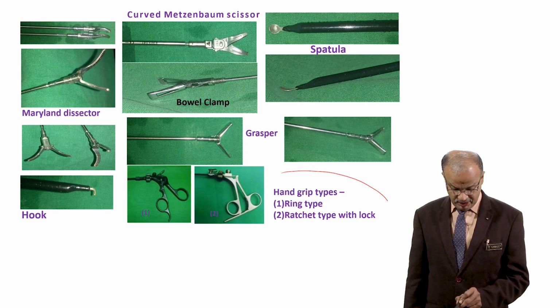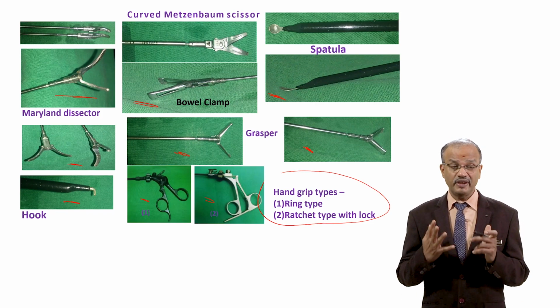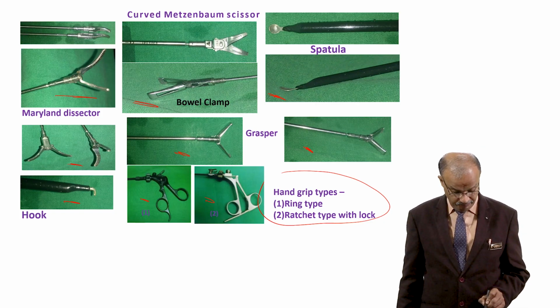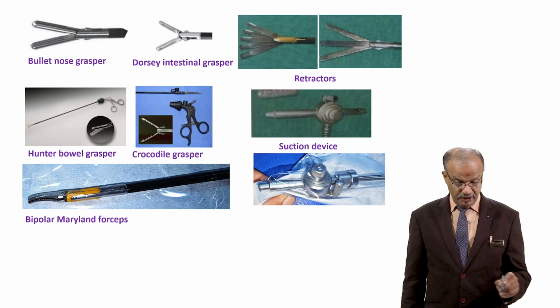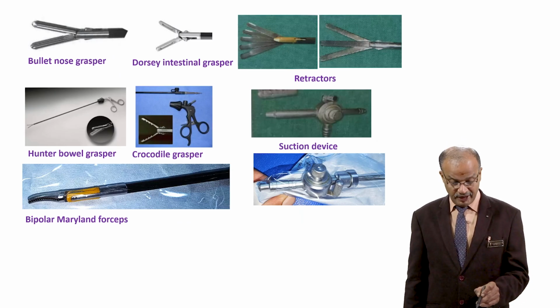These are very important things. These instruments are the basic instruments. They are very important for basic laparoscopic surgery or all laparoscopic surgery. Again, same, different graspers. It's a liver retractor, or retractor for any soft tissue. See that fan, the fan retractor.